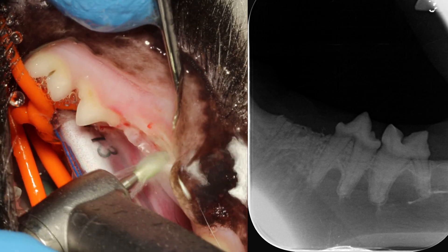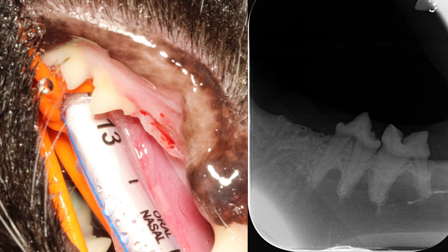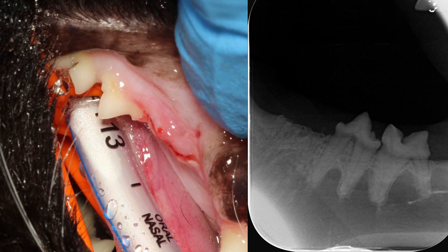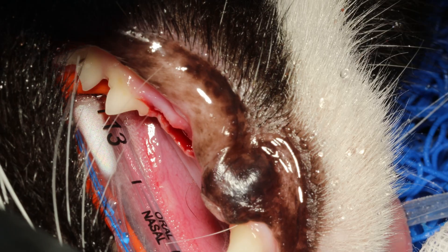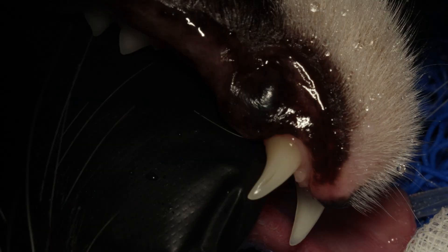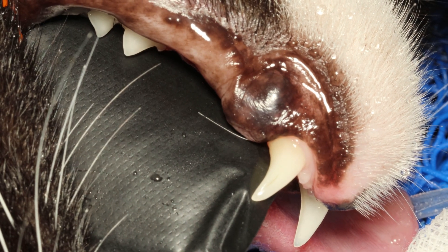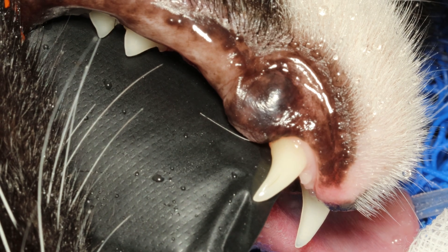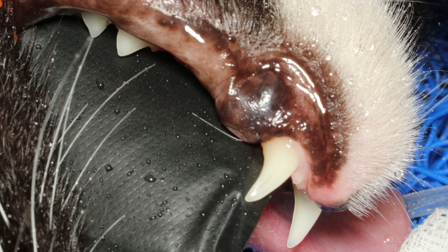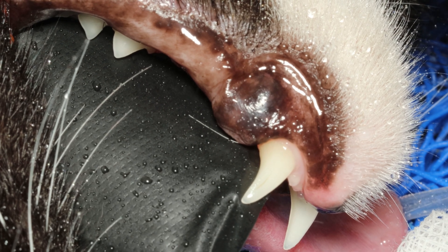You can see in the x-ray that I got the crown off. There is a tiny remnant of periodontal ligament space mesially — you can see that black line — but that is okay. It is being resorbed as we speak. You can go a little bit deeper with your burr in that area to release that if you want to get rid of it, and it will progress that resorption.